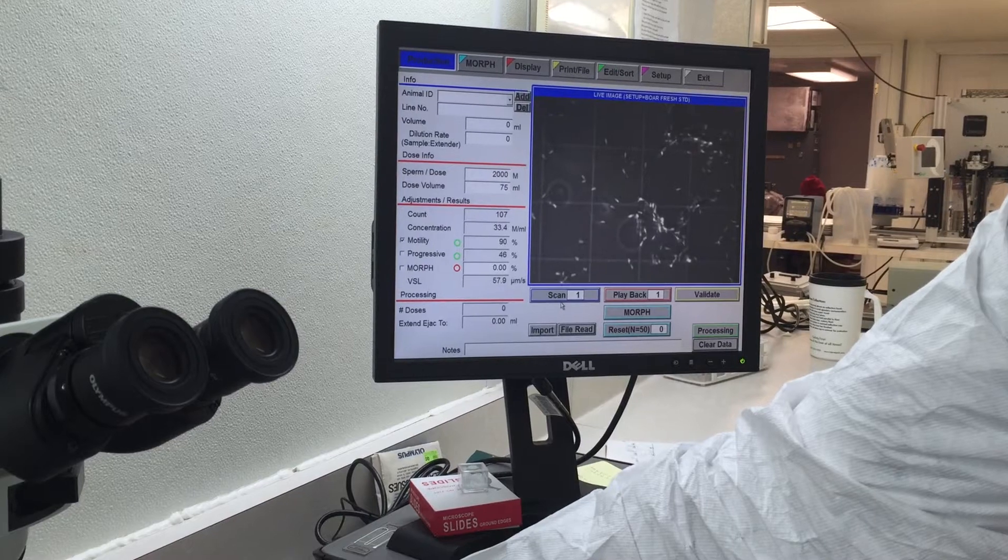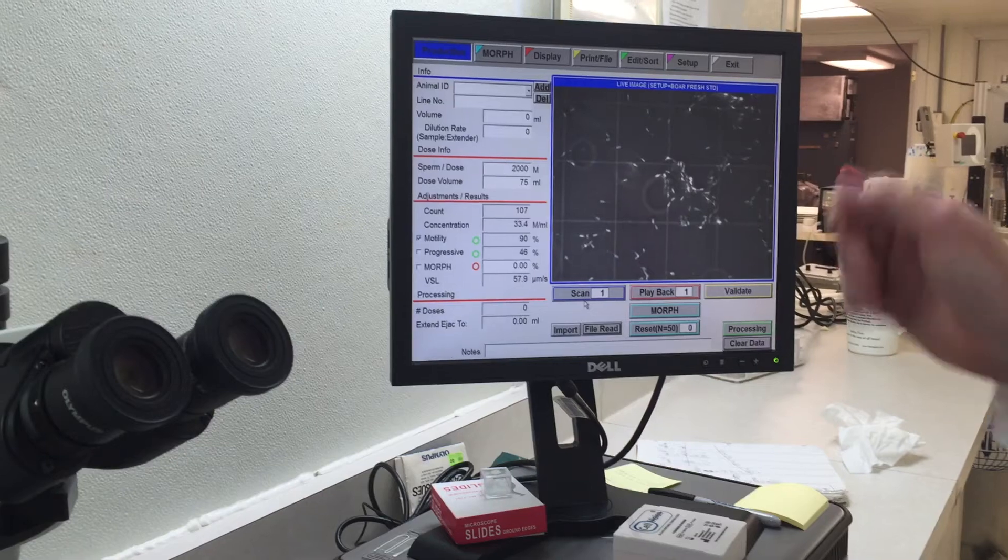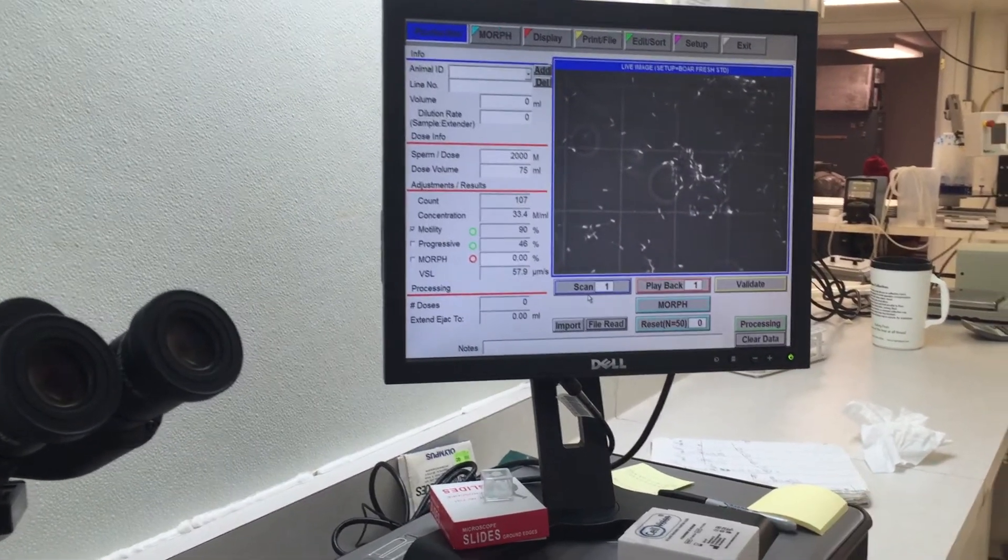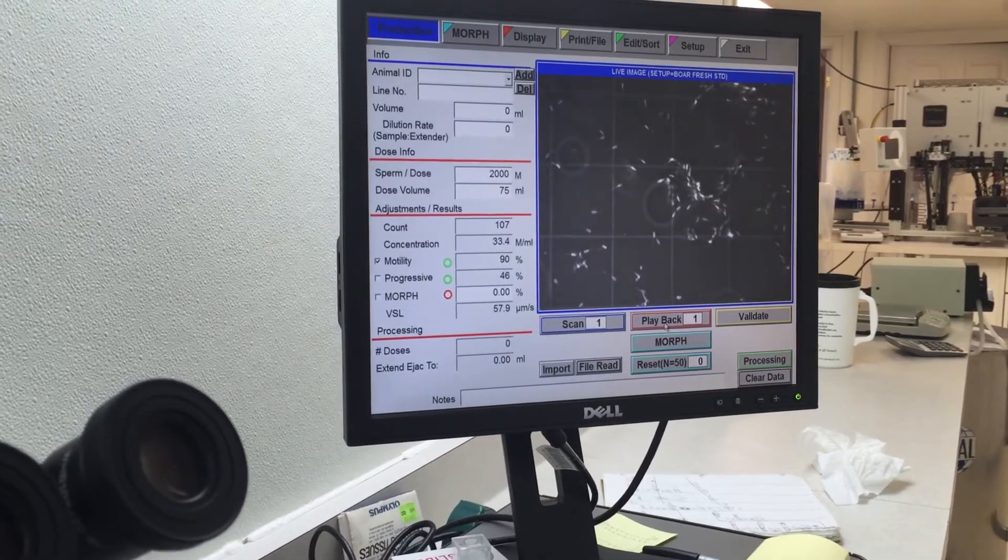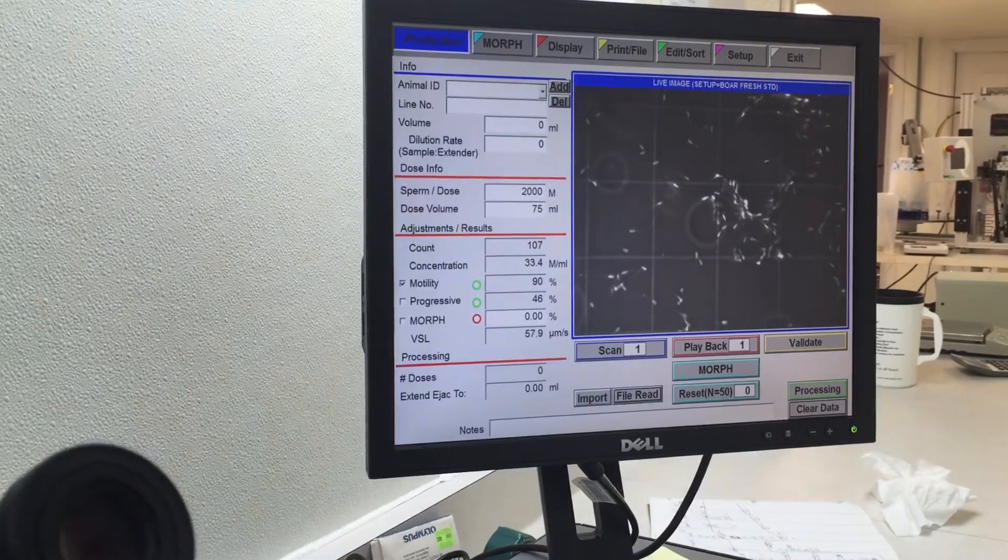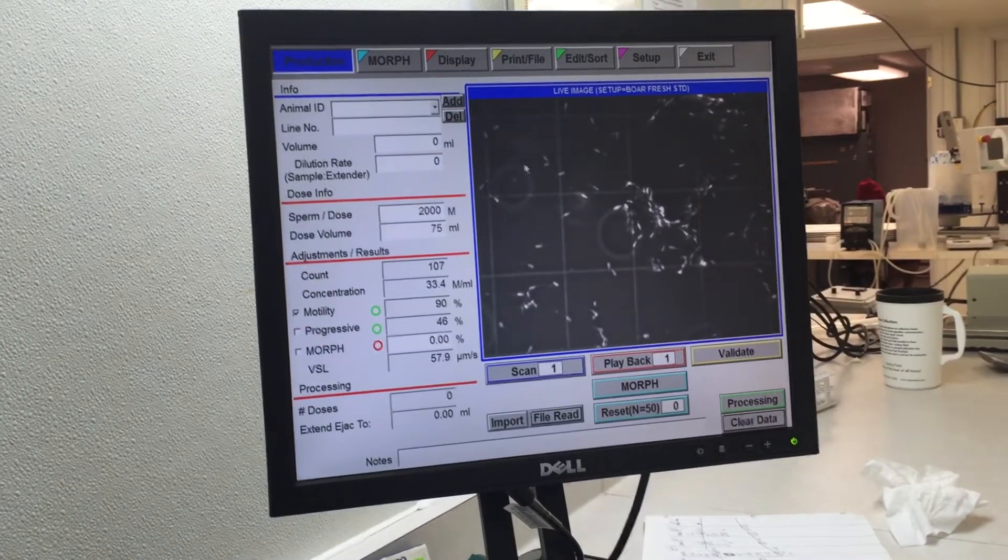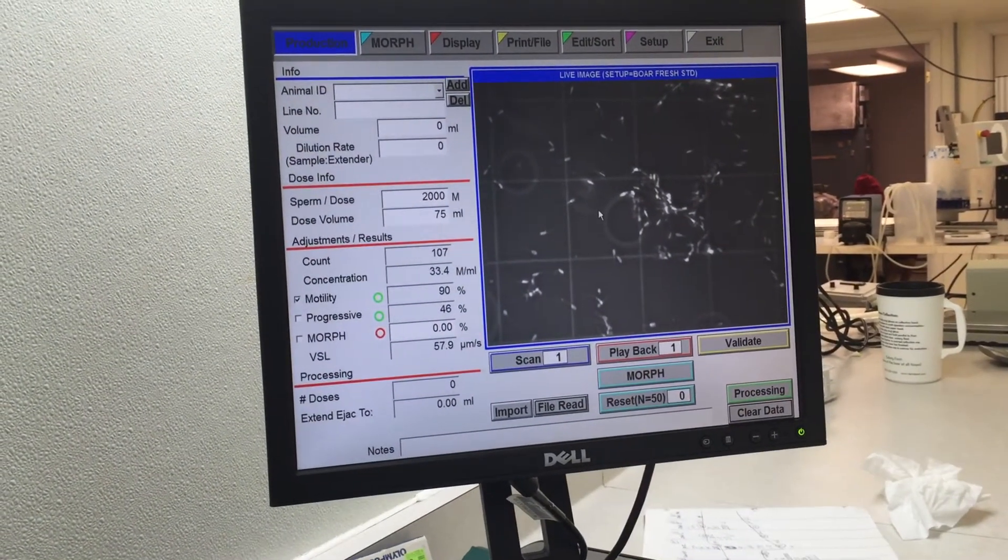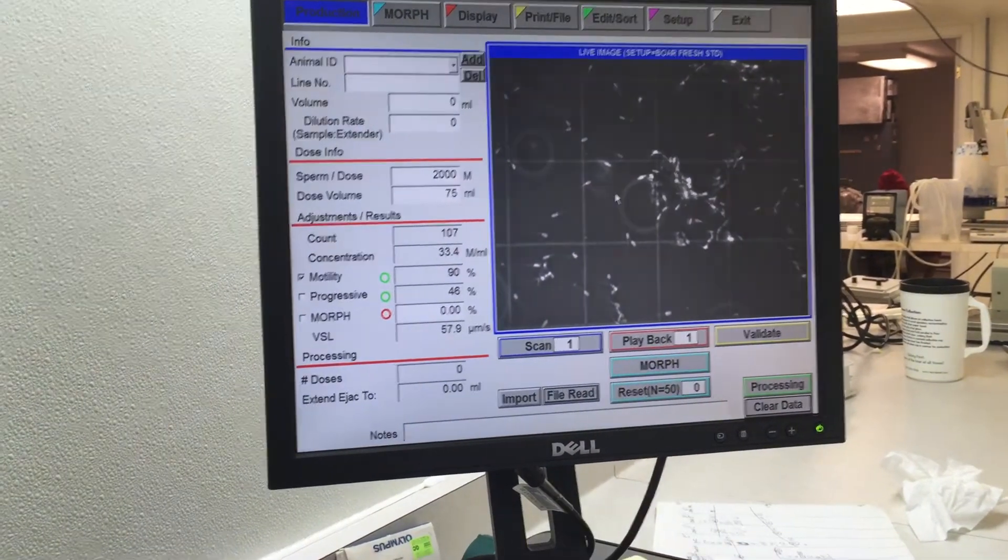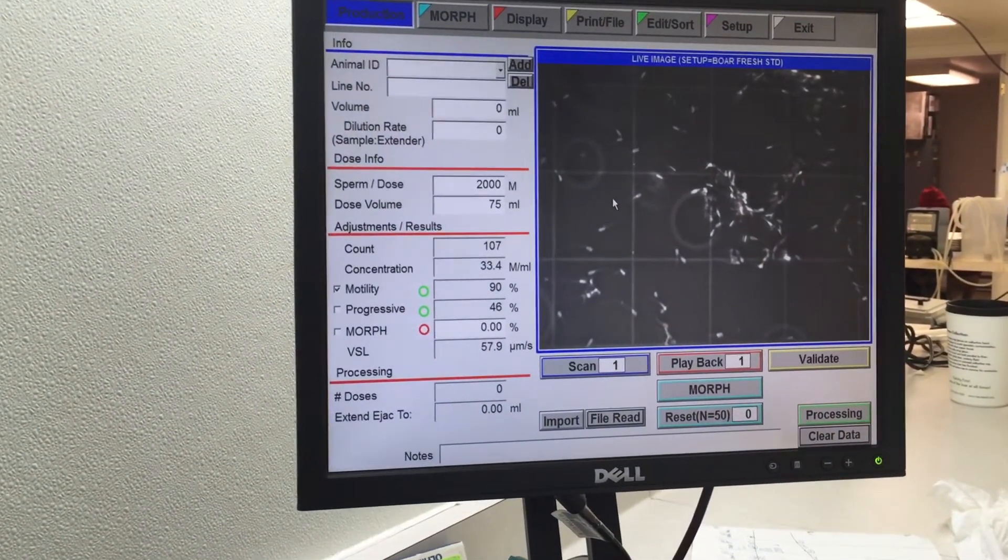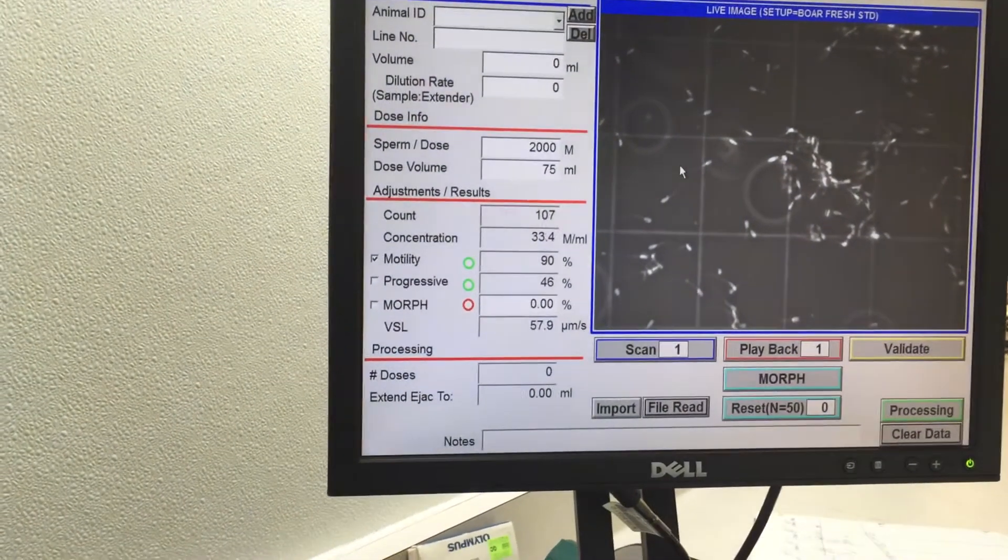So the grid has ten little squares across and ten little squares down, so ten by ten. What we need to count is the number of cells within each square in one row of ten. We want to do two rows or two columns, or one column and one row—basically two readings per chamber. Since we loaded both chambers, we'll end up with four readings. We'll average the count and use that average to calculate our concentration.